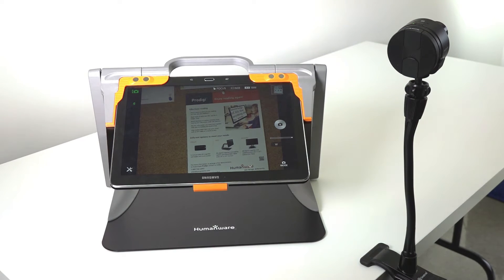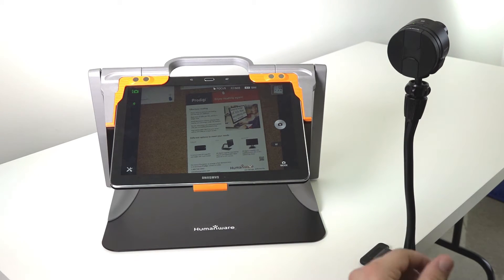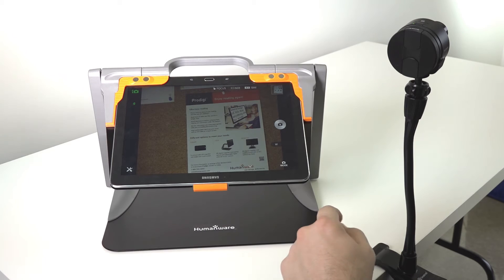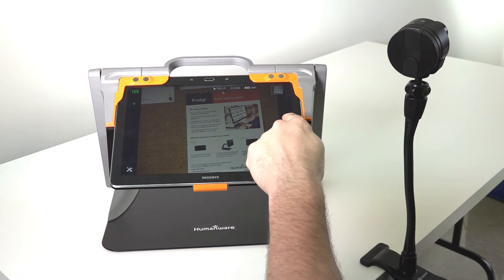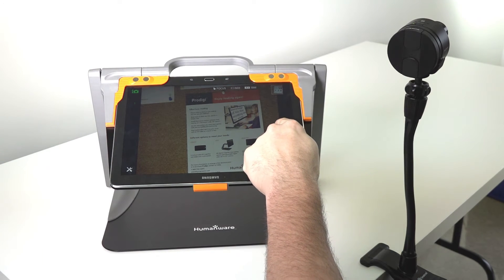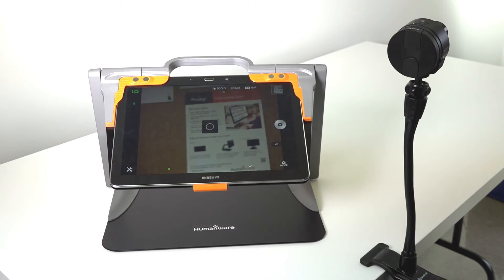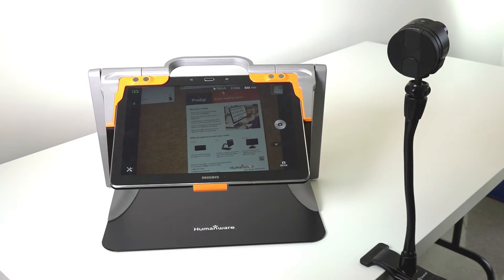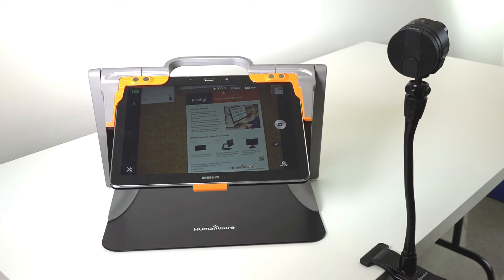Once you've found the article or the area that you'd like to magnify, press the capture button and the picture will be transferred wirelessly to Prodigy to be viewed later.